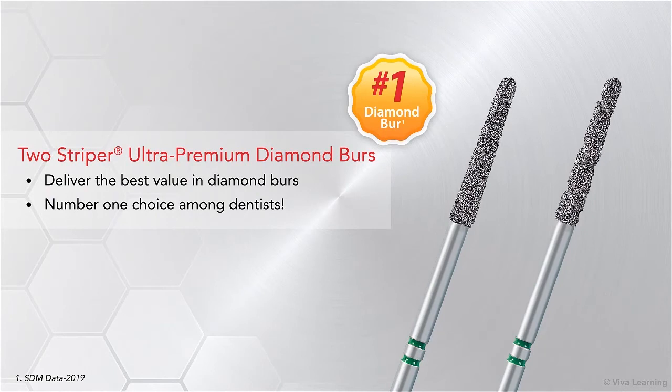In summary, the Two-Striper Ultra Premium Diamond Burrs deliver the best value in diamond burrs. It's no wonder Two-Striper Ultra Premium Diamond Burrs are the number one choice among dentists.